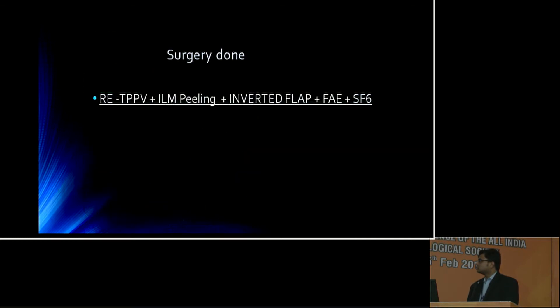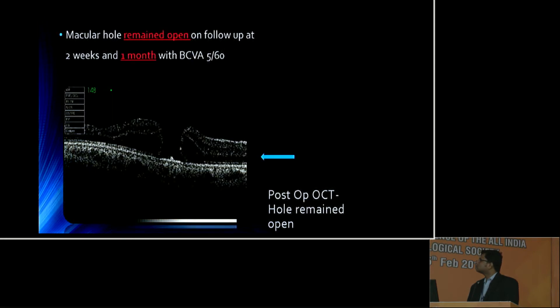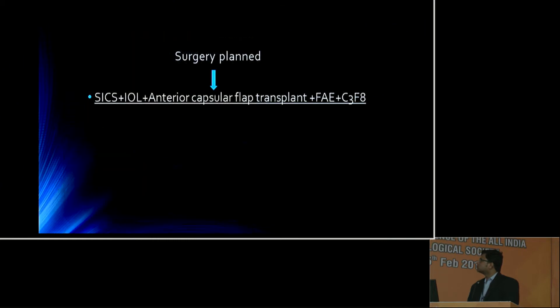Standard surgery of pars planar vitrectomy, ILM peeling and inverted flap technique with SF6 gas was done. The macular hole remained open at one month follow-up and the visual acuity was 5/60. Then we planned for SICS-IOL and anterior capsular flap transplantation into the macular hole.